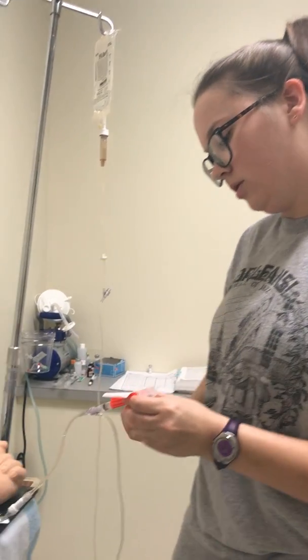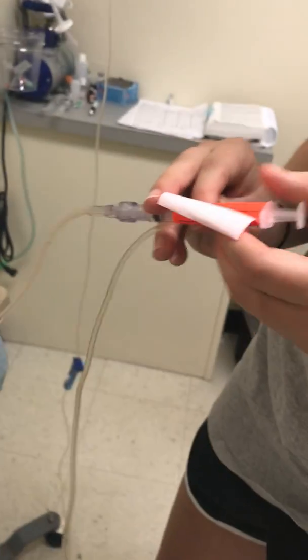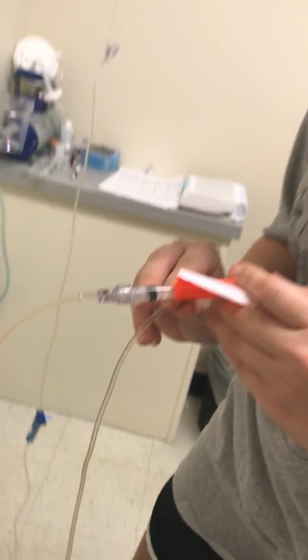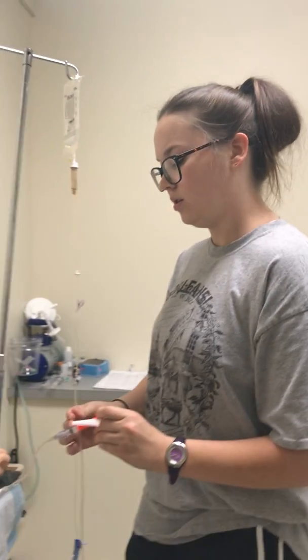Okay, gonna put the fourth one in. A little over 1 milliliter. Unkink.